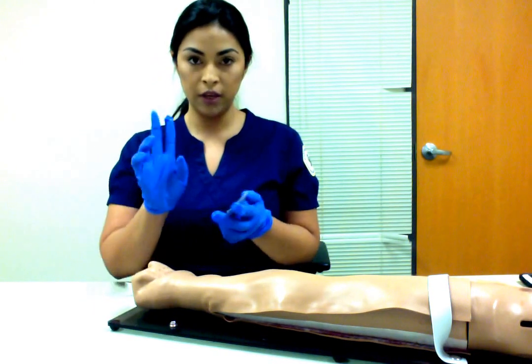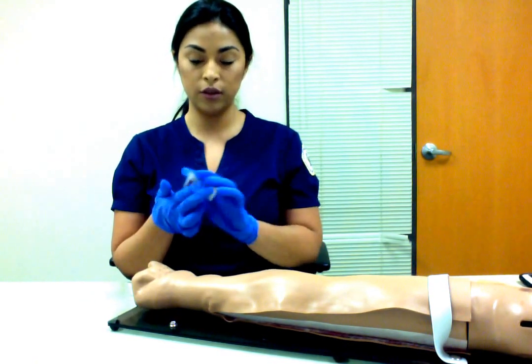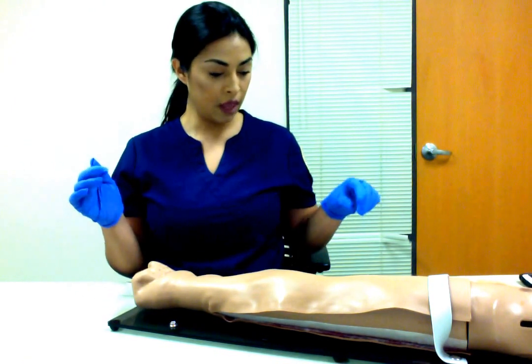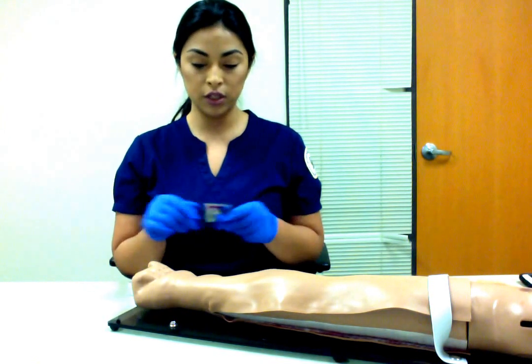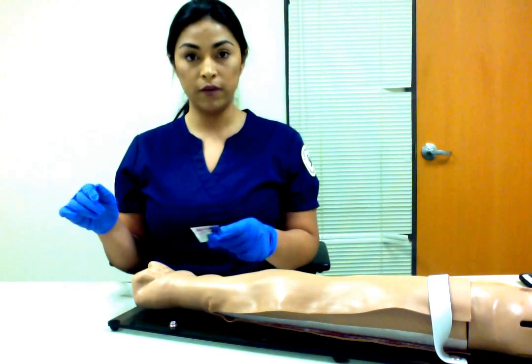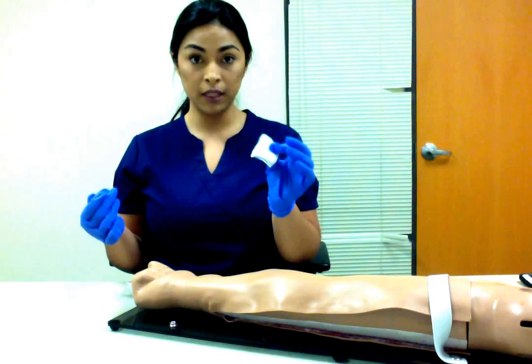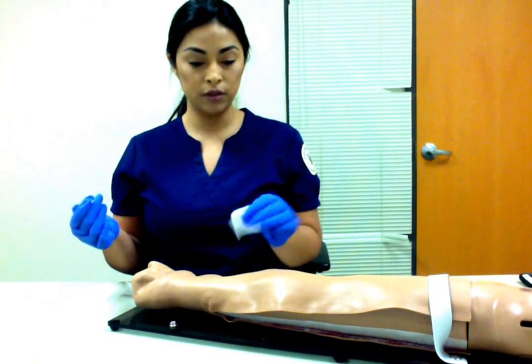And it would be a good idea to clean the fingers that you are going to be using to fill. So clean the tips of your fingers. And then again with the alcohol prep pad, do the same procedure. Start from the site, rotate around it until you are 2 inches away from the site. Ask the patient if it's okay if you place the gauze upon their arm. That way it's ready to be able to use and apply pressure.